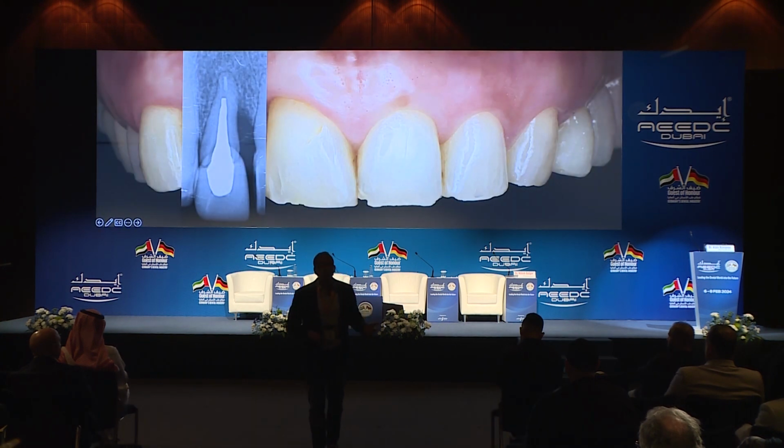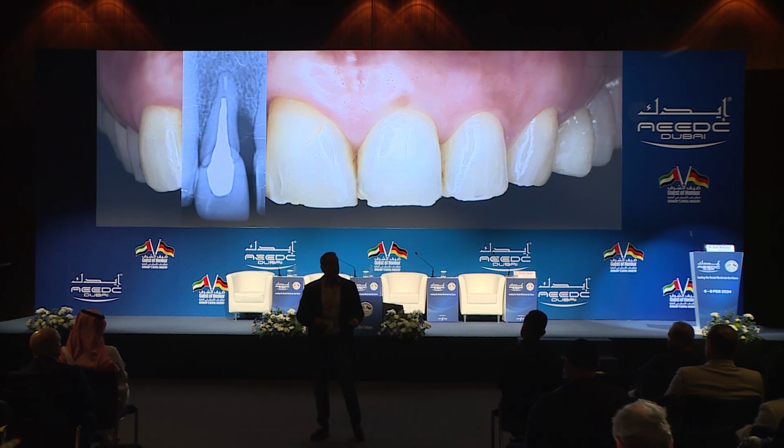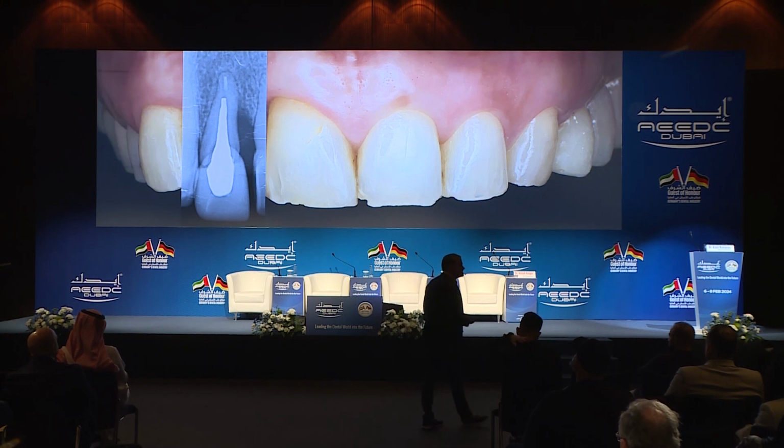My treatment plan was to do socket preservation. I told her we cannot place the implant immediately because you're losing bone and you have no interproximal bone here, so probably we have to stage the case. Let's do bone graft, soft tissue graft, wait, come back, place the implant, wait, come back, remodel the soft tissue at second stage, and then final prosthesis. But she felt I was too expensive.